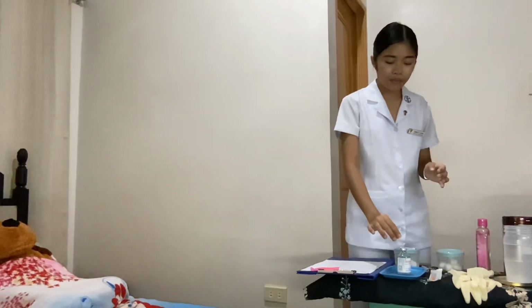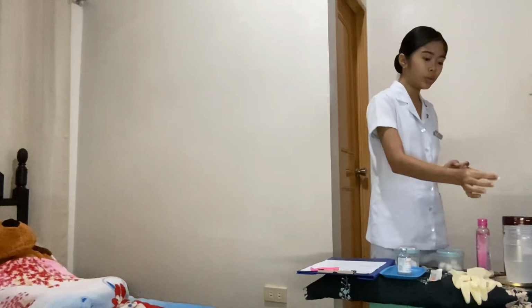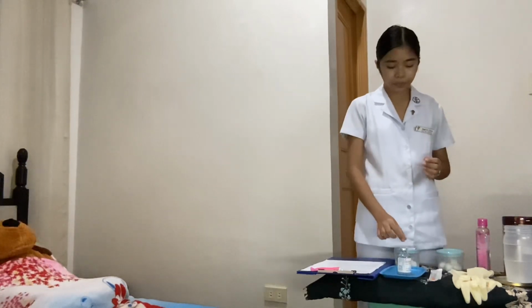Then the next thing we're going to do is to remove the protective cap from the vial itself. And then, after you remove the cap of the vial, you're going to throw this in our trash receptacle.